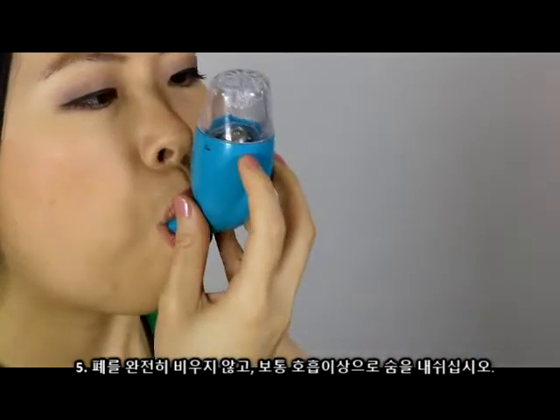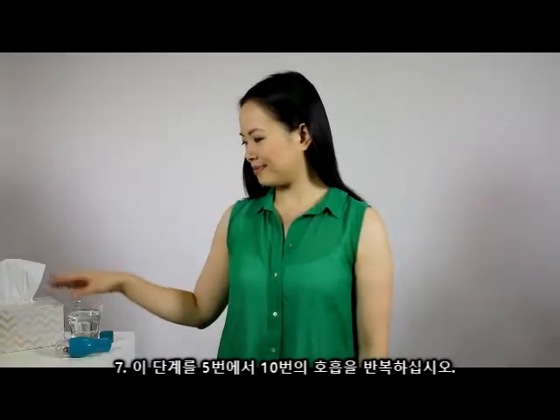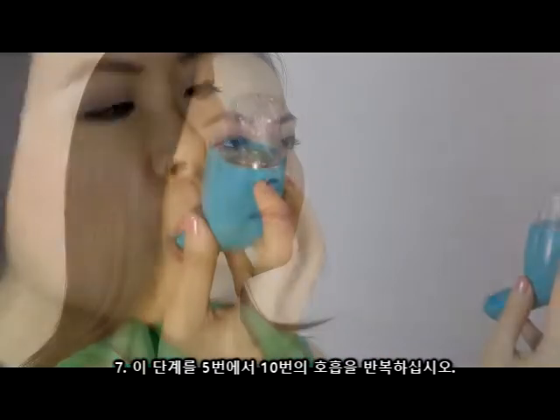Step 5: Exhale beyond a normal breath but do not empty lungs completely. Step 6: Attempt to suppress any coughing. Step 7: Repeat these steps for 5-10 breaths.